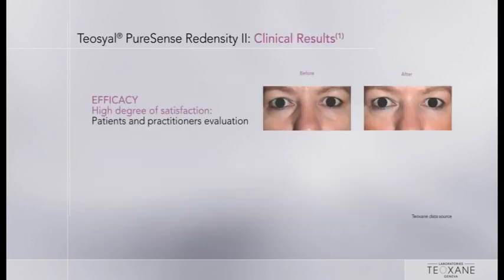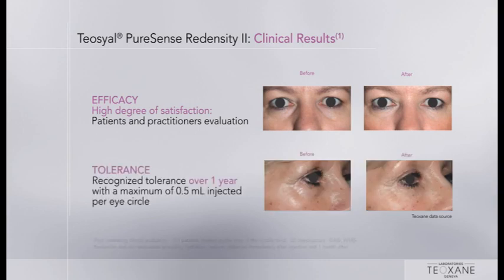The clinical results show a high degree of satisfaction from patients and practitioners. The results are immediately visible after injection, as shown on this before and after picture. The excellent tolerance of Redensity II was also demonstrated in the clinical studies.